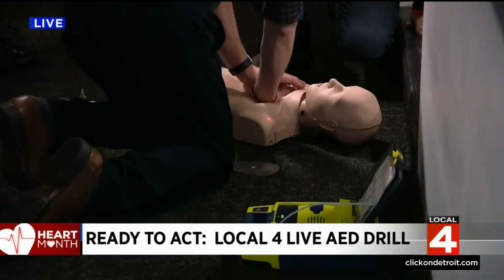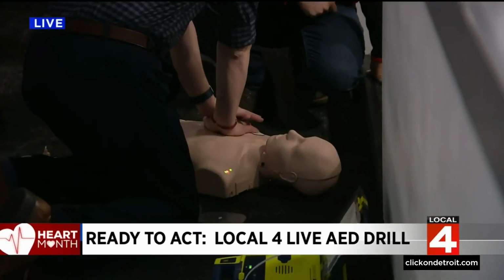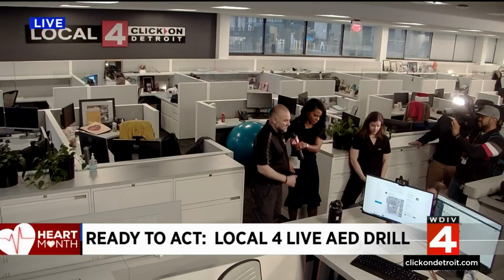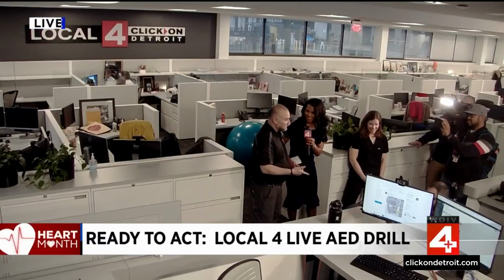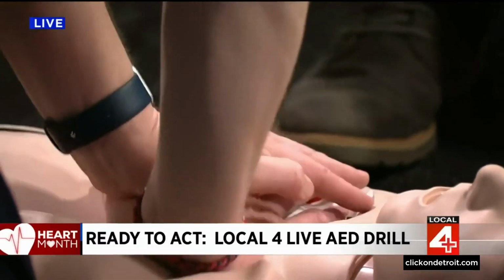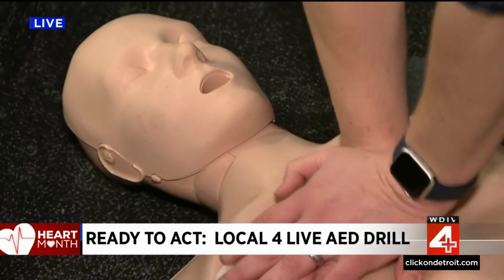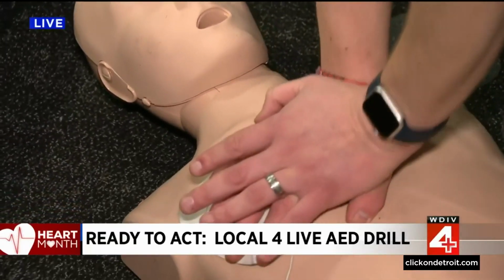All right. Good switch. So what you want to do is make sure you minimize how many interruptions you do with CPR, and that's why you switch after you deliver the shock. So that way we're not having unnecessary further interruptions. We did a good job. And that's pretty much it. So this is the whole cycle. It's going to be every 2 minutes. That's going to take you through a cycle, and you swap off, and hopefully EMS will get here shortly. Hopefully you send a guy up front or a female up front to guide EMS back through here. And let's talk about what those 4 steps are and how we did.